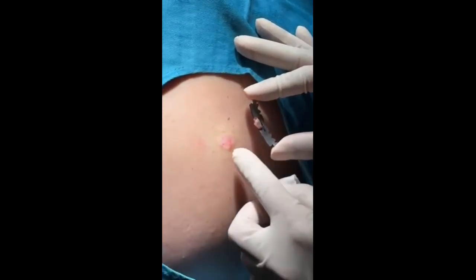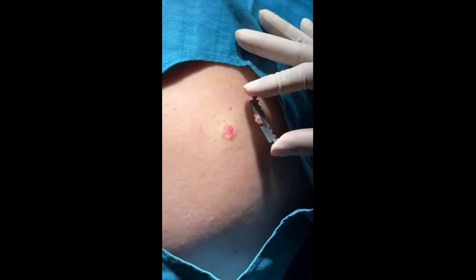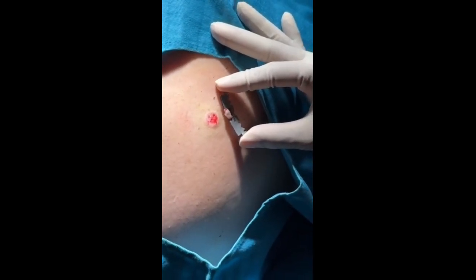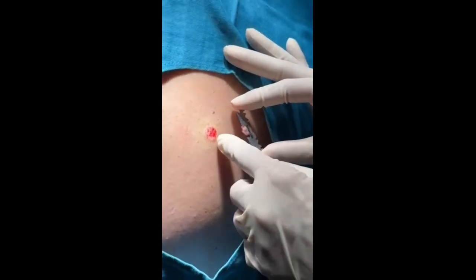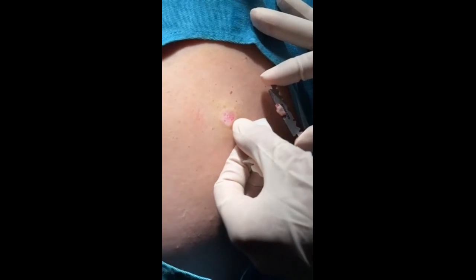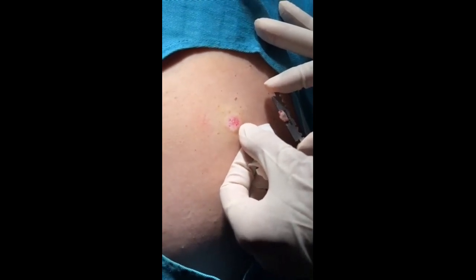You can see the deep part of the dermis. The healing takes about one to two weeks. We cover it with a hydrocolloid dressing. You see the lesion, you see the bed — the bed consists of the deep layer of the dermis. The epithelialization is coming from the bed and around the wound.